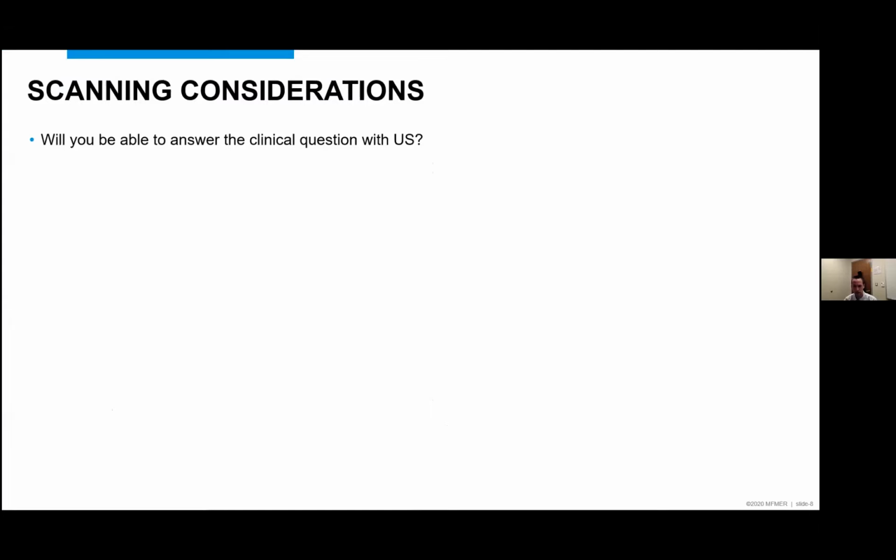But there are some things that are deeper or a little bit more difficult where you might find yourself often getting an MRI. And that's the time when the patient comes in with a referral for a dorsal wrist scan. You have to ask yourself, is there a very high likelihood I'll be getting an MRI? And should I be proceeding with this scan? Usually that's not the case, but something to consider.